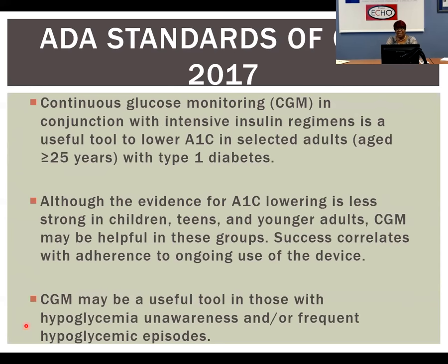I wore the device, and I don't have diabetes, but I sometimes get a little hypoglycemic because I forget to eat. So I'm sitting in the room with the patient, and as I start to talk, this thing is buzzing. I'm like, excuse me just a second. So I glanced down and it says my blood sugar is 67. I'm like, okay, I feel all right.